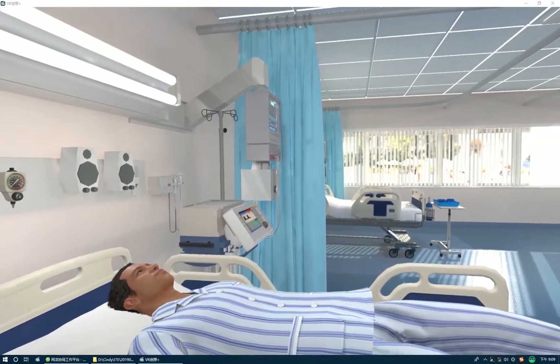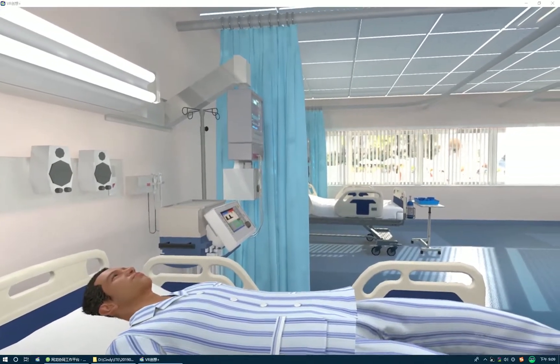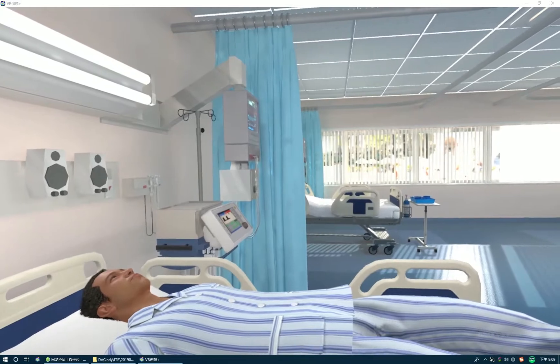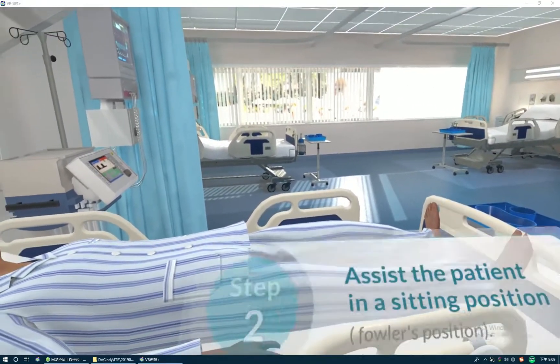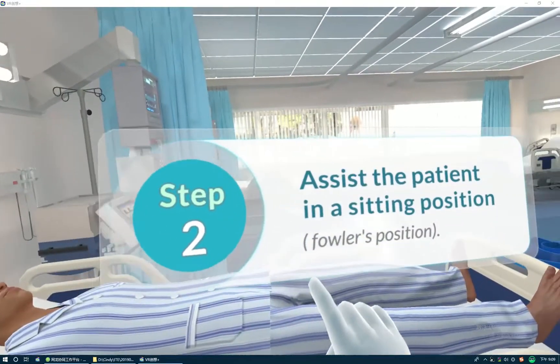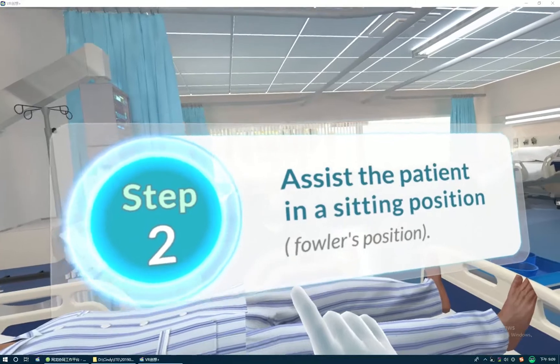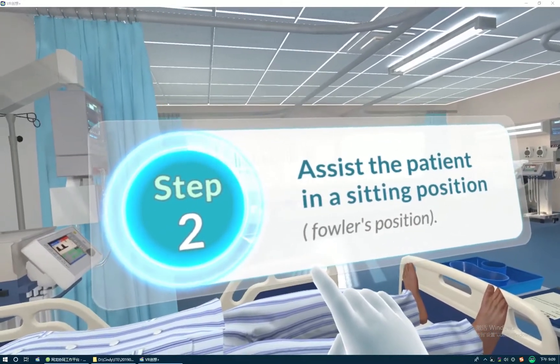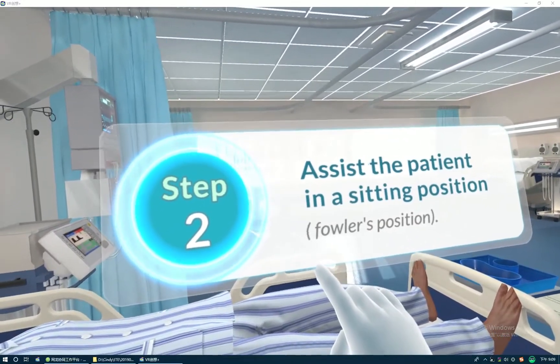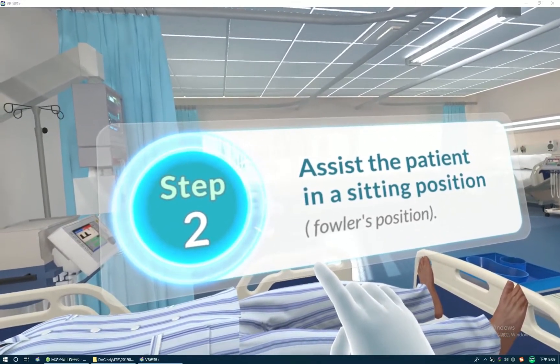Now you are ready to adjust the bed. Use the bed controller. Assist the patient in a sitting position — Fowler's position.